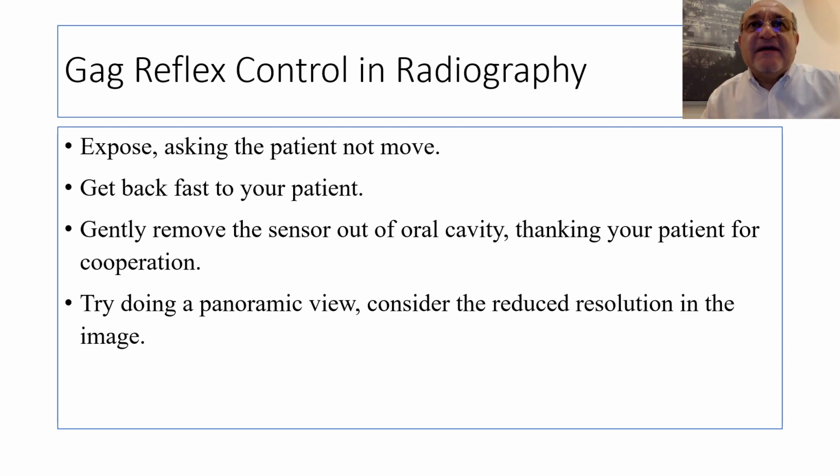Go fast and expose. Okay, and then you ask the patient not to move. Please don't move. I'm doing the exposure. Click. Okay, and then after you've done the exposure, go back to your patient again. The idea is to keep the sensor the minimum time inside the patient's mouth.